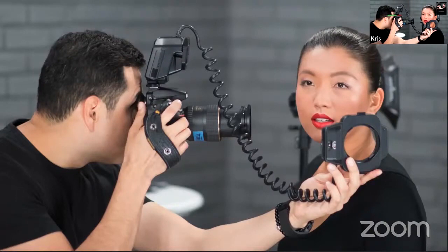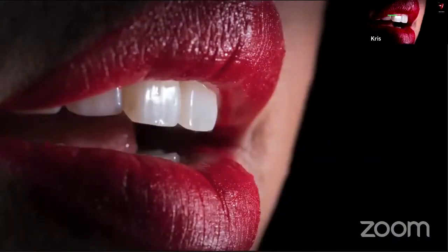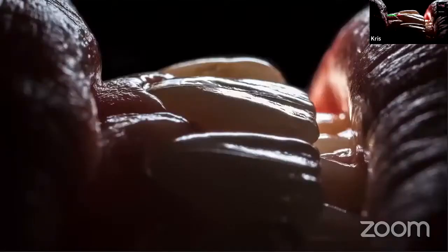So you have to know how to control the volume of the light, the quality of the light, but as well where you place it, how you position this light. So it gives you the chance to take some shots from the sides, from different angles, just to highlight this type of, let's say, beauty photography, just to show some texture of the teeth. And depending on the direction and the power of the light, this needs some practicing, but it's a lot of fun.